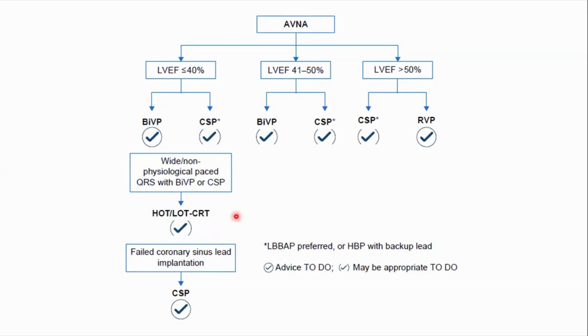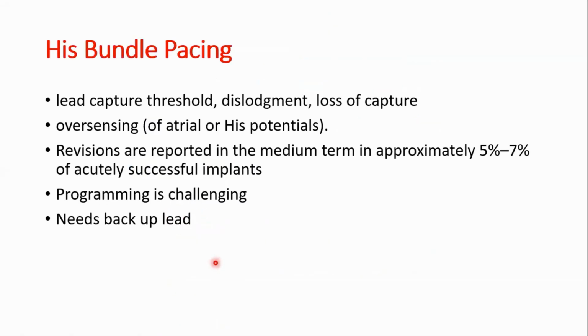not conventional CRT. And always remember, you should prepare your backup left bundle area pacing lead or His bundle pacing lead for conduction system pacing. This is the final slide.